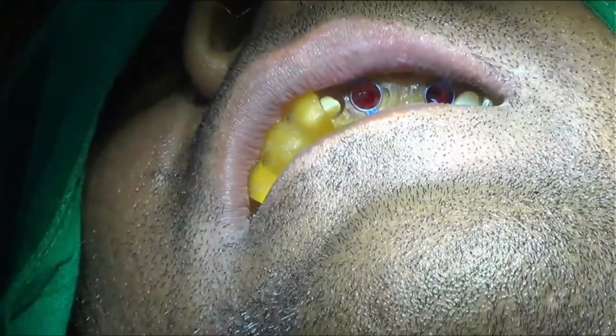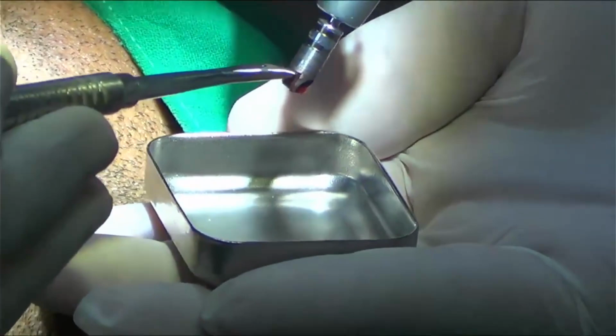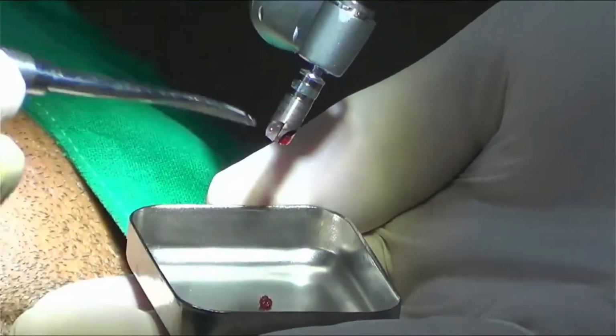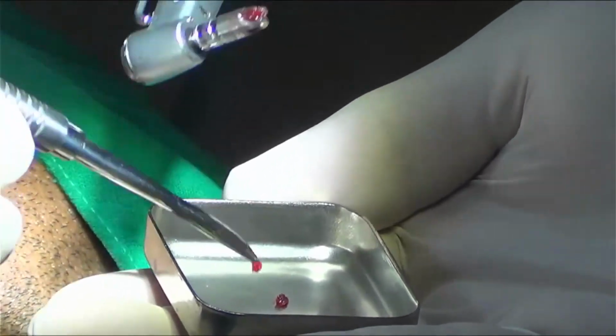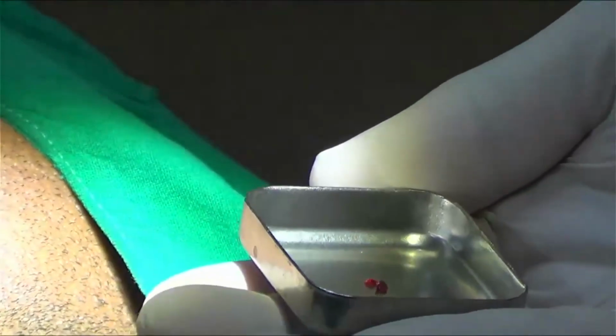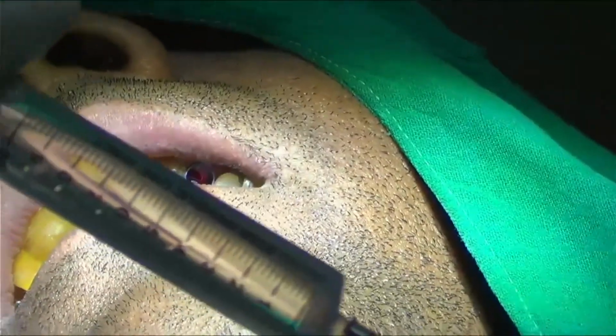So I have to remove this bone, and I can save it for my further bone grafting. Do not ever leave your bone or tissue like that. You always should put saline.